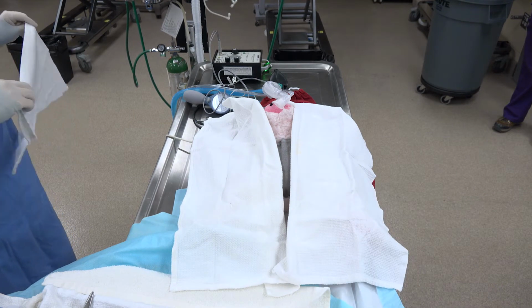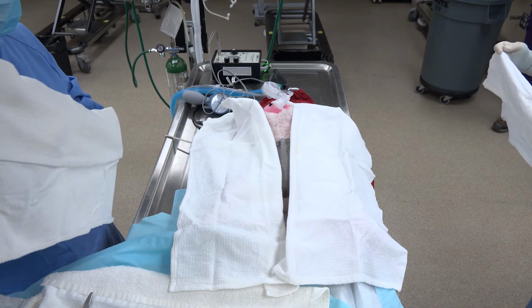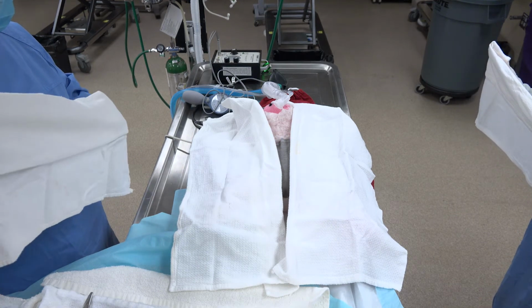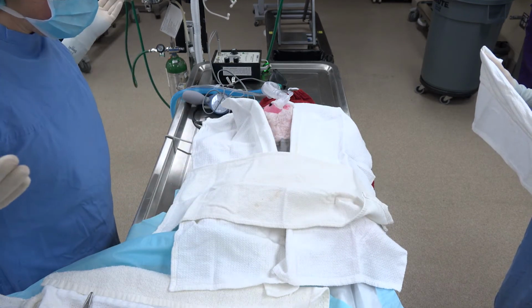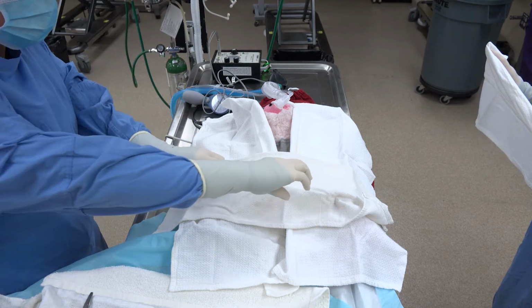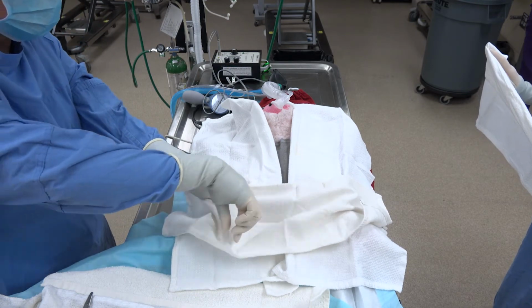The other thing that you need to be thinking about is where your towels are going in relationship to the animal's anatomy. Now for a spay, you want to drape from the xiphoid to the pubis. So I don't want to stick this guy clear up here, but if I did and I thought, oh no, I'm too far up, I'm not all the way to the pubis, I actually can take this and pull it back to where it's at the pubis.